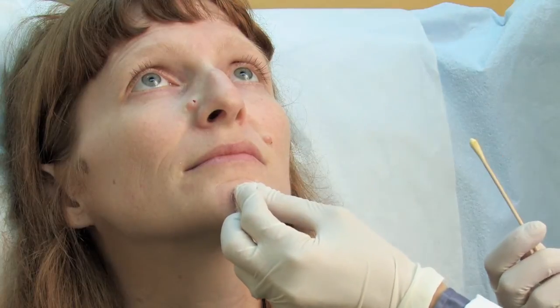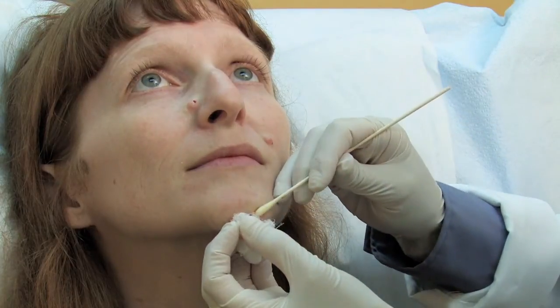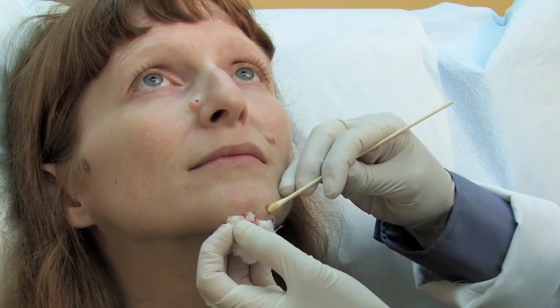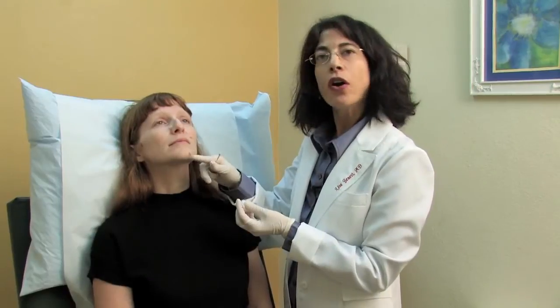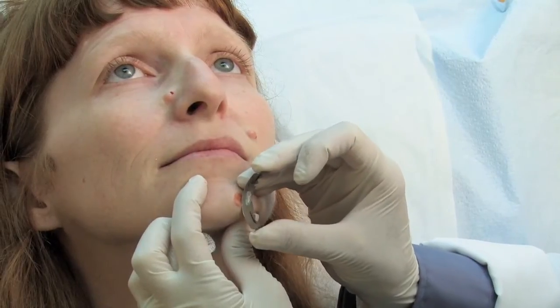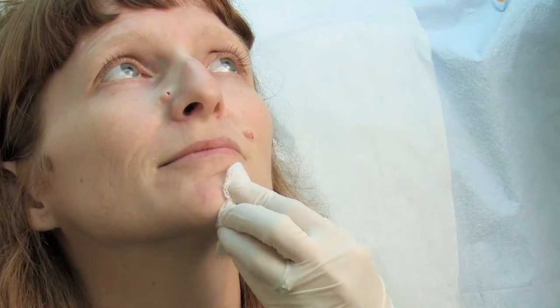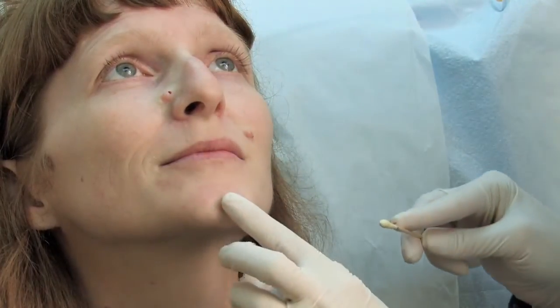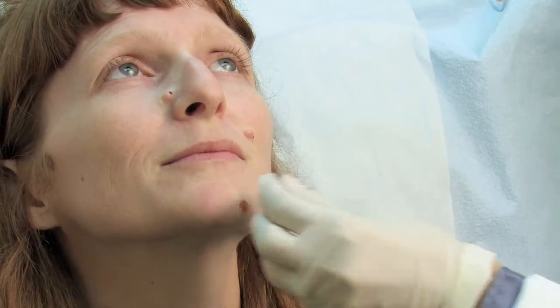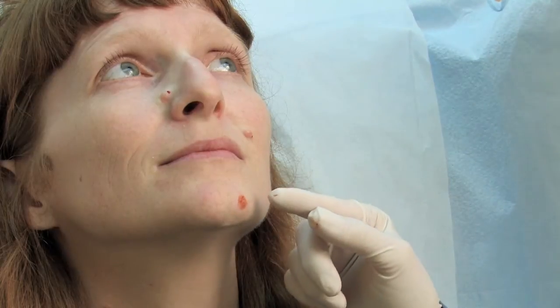The next thing I'm going to do is put a solution that can stop the bleeding for us. That completes the first step of removing the mole. The next step is to smooth out the edges so the contour is even. And finally I'm going to use something called cautery, or a hyfrecator, to get any remainder of uneven edge nice and soft.